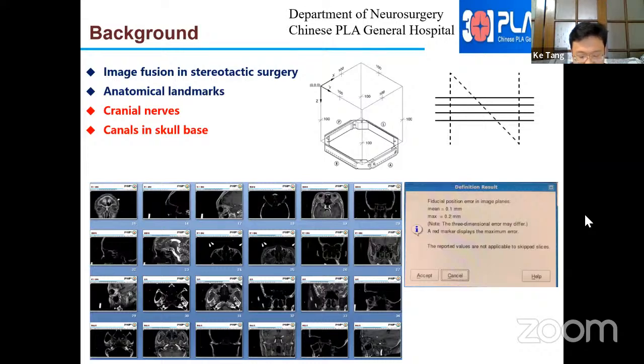So, precise target localization can be realized by a combination of accurate stereotactic space in CT and clear anatomic identification in MRI. The application of multimodality imaging co-registration to stereotaxis avoids the problem of additional intraoperative MRI and reduces the time of stereotactic head frame immobilization.